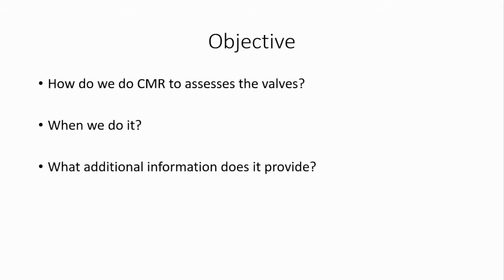Echocardiography, as we know, is the major modality for assessing valve disease. Cardiac MRI can provide not only standalone assessment but also add value and complement echocardiography. So in this video, we'll see how do we use cardiac MRI to assess the valves, when do we do it, and what additional information does it provide.